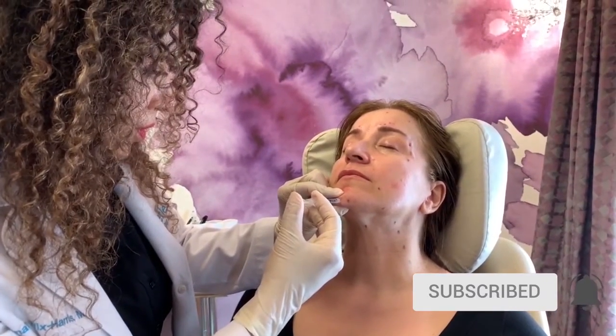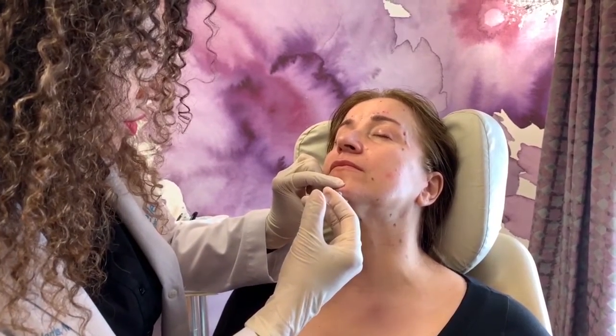With her chin, we're using Botox to smooth out the dimpling that occurs from a hyperactive muscle.